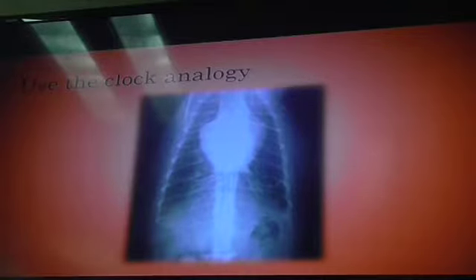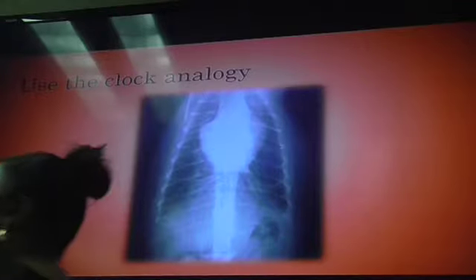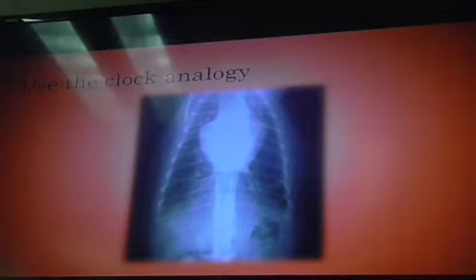Now what we're seeing is that sometimes they can just have left atrial enlargement or right atrial enlargement. Not all the time is it both at the same time. Typically when we do see these babies, they have progressed to biatrial enlargement. So this is that Valentine heart. These are all terms that you'll get used to and you'll hear again and again and again.